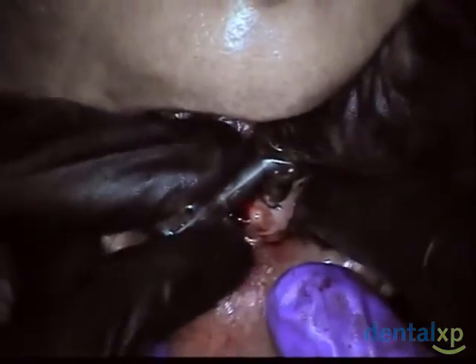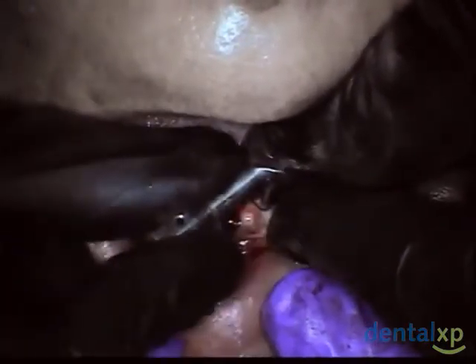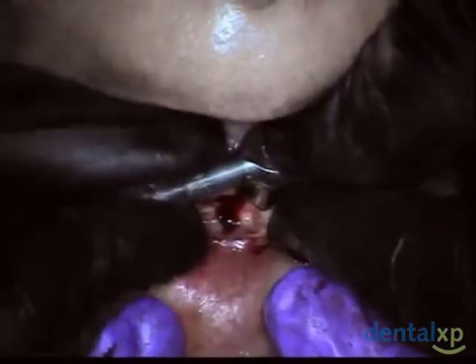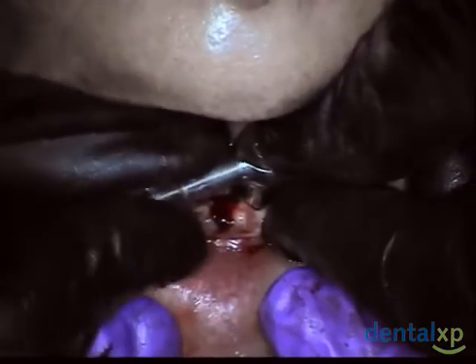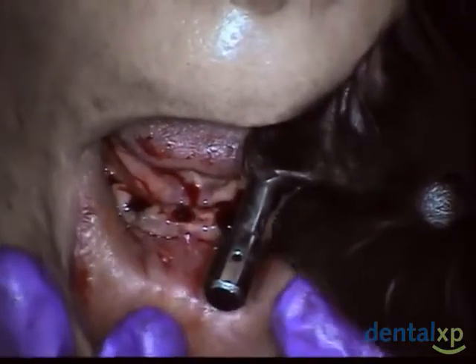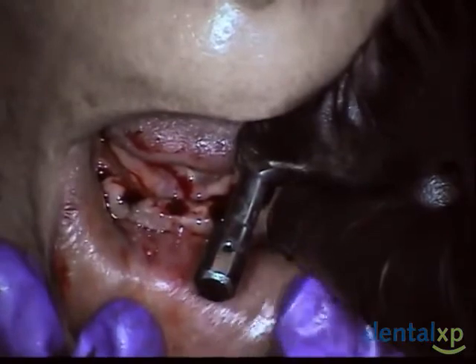And so I'm still with finger pressure able to drive this in place. Therefore, if I would have tapped this, I may have made my osteotomy just a little bit too loose, or I would have created a type 3 or type 4 bone situation in a type 1 bone area, which means that I want to be able to have this implant do the tapping, which also translates to mean that the less distance the bone has to grow, the more secure the implant will be in a shorter amount of time.